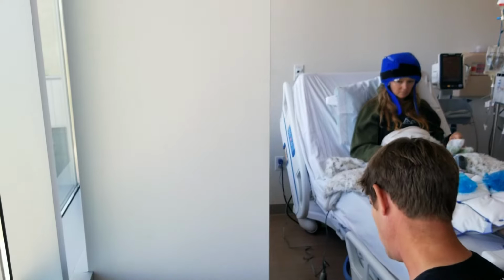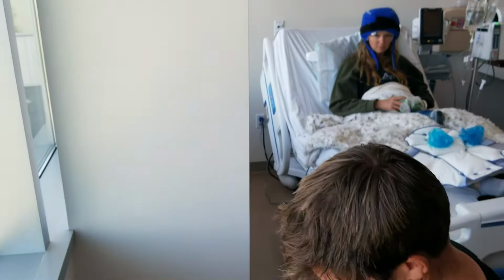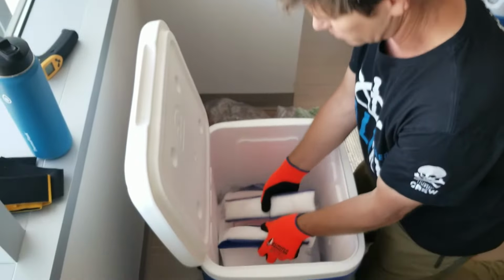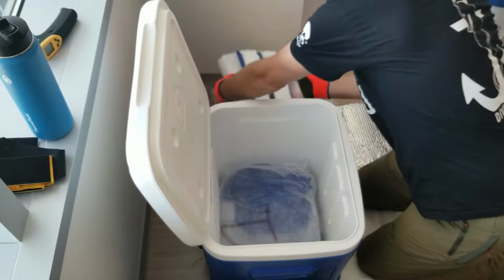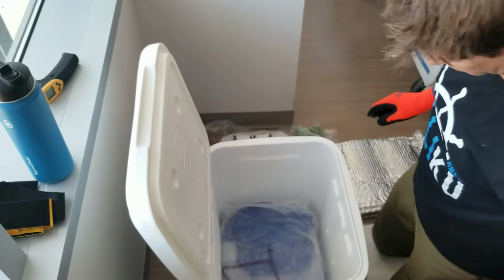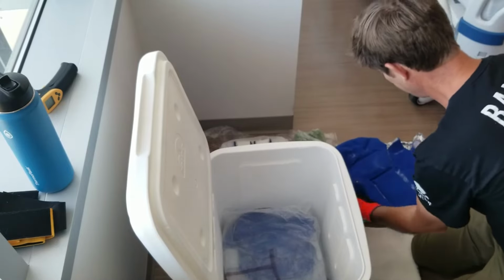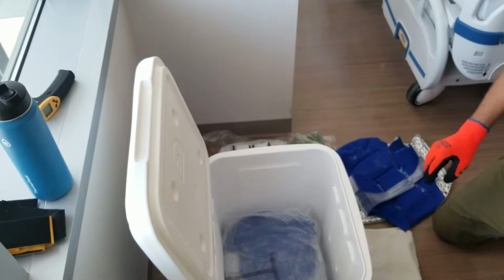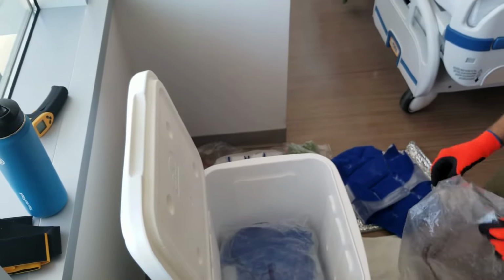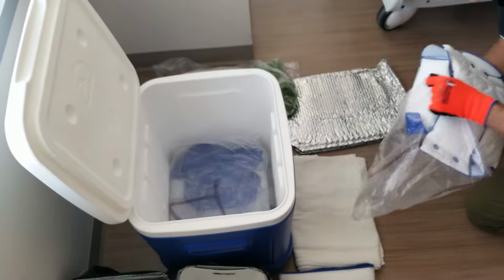I've heard that you're only supposed to use it like a half hour before chemo and a half hour after. There's all kinds of different things you can read about, but she's been doing it the whole treatment here. So I just take a layer of ice out, and in order to remember where I was, I get this one ready, and I find the bag that I had from the one that just came out, and I put it into a bag.